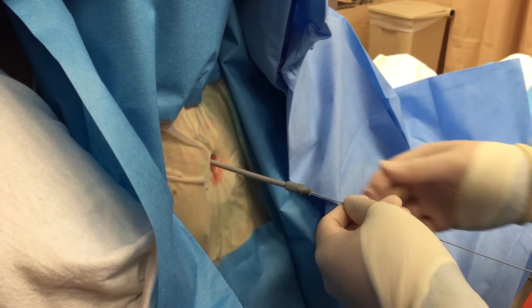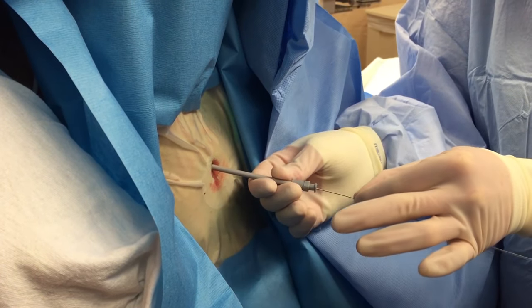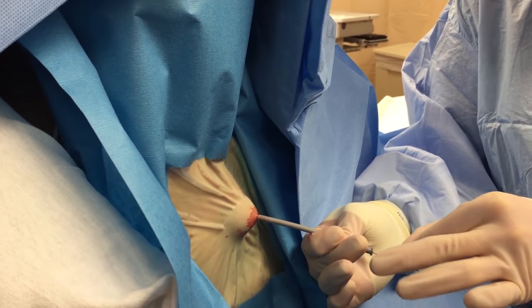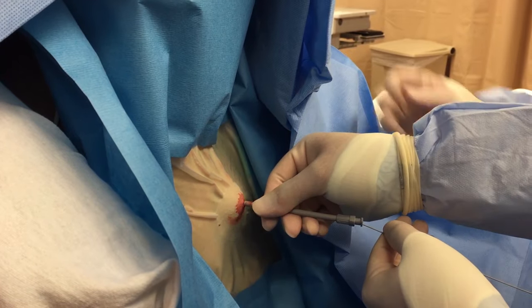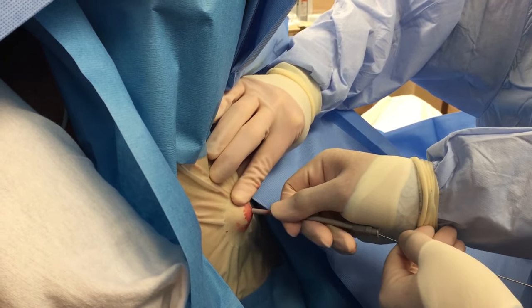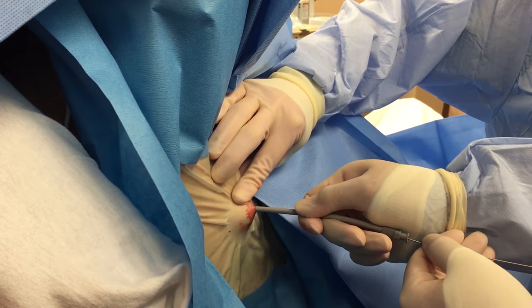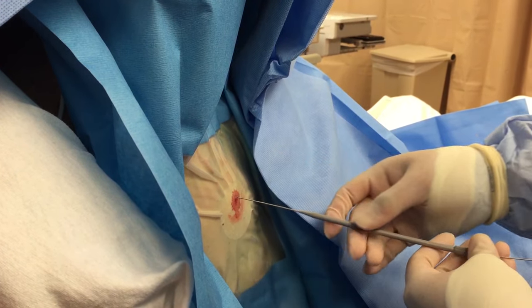Wire stays steady. The dilator comes out over it — it's called a pinch and pull. Have you ever done a pinch and pull? No. All right, let go of everything. So you pinch the wire and you pull back like a centimeter, then you repinch the wire and pull back another centimeter. That way the wire doesn't buckle over your dilator. And you're ripping fascia as you're doing this, which is great. So keep twisting as you pull out. Twist, twist, twist. Good. Grab your wire. Well done. That was the worst.